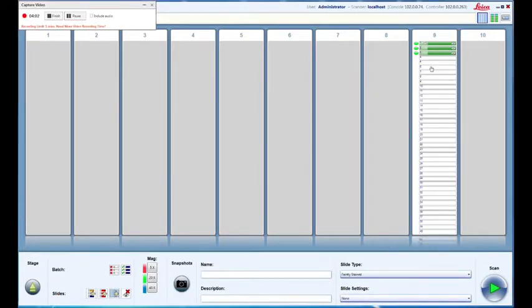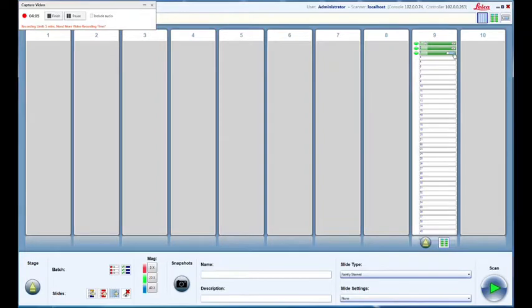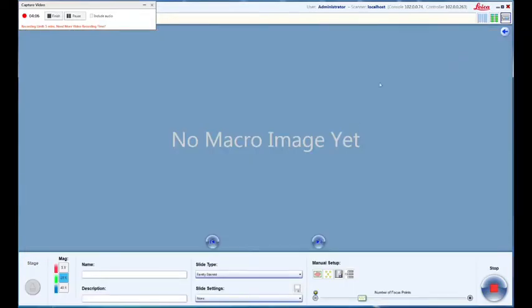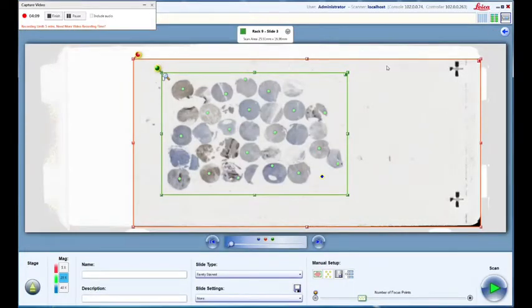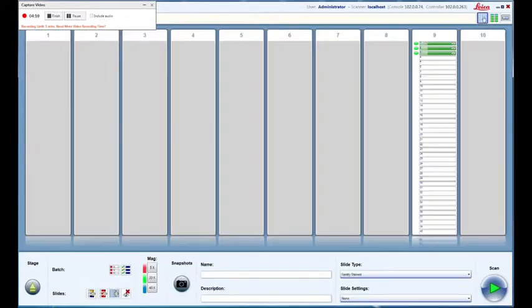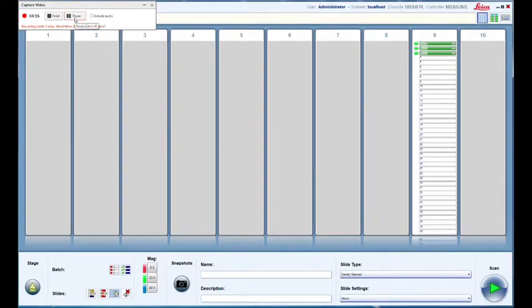Everything's been scanned now. Everything's green. We can take a quick look at the macro image. There it is, everything's focused on and has been scanned. At this point, we can move on to the next part of the Aperio loading process and move to actually creating a case.